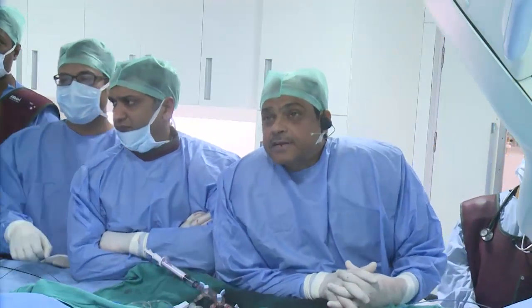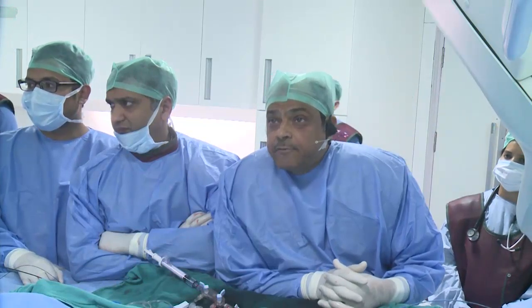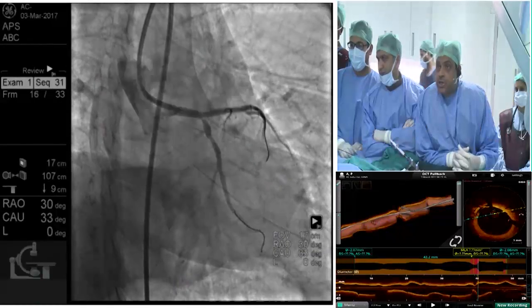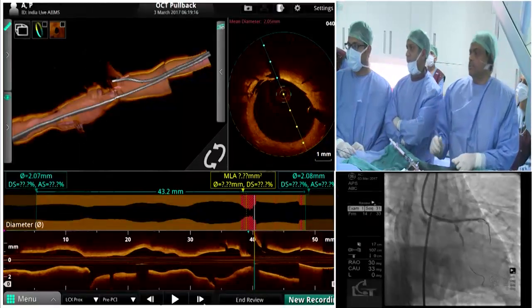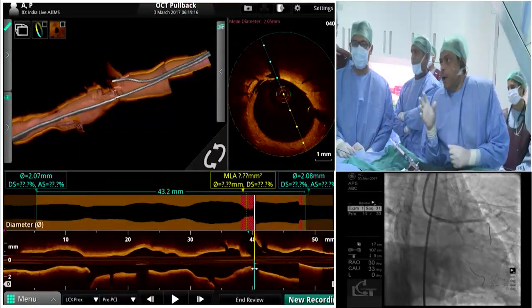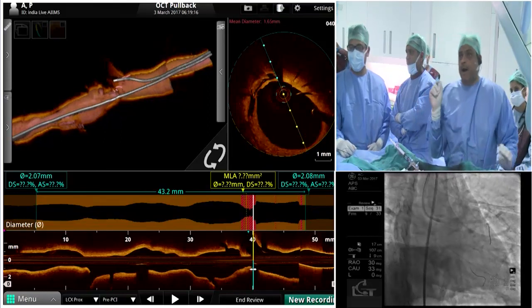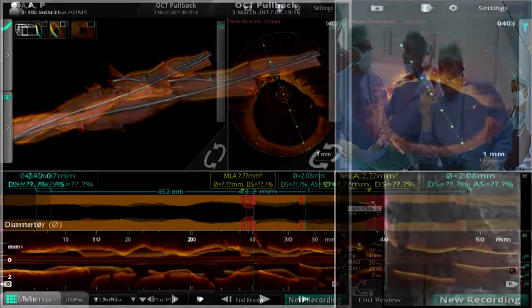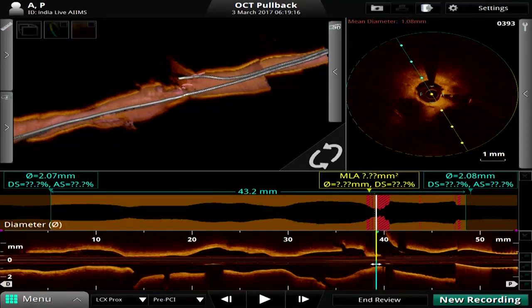We are back. Dr. Bahl, we tried with another 2-3 balloons. Yeah, we tried with the cutting balloon. We could do it, but it didn't open. So now we have recorded an OCT from the circumflex. Show the OCT. The problem, I think, is because the struts are the closed struts. This is a BioMime stent which has a hybrid design. So maybe at the ostium, they are closed cell design. So we are not able to open.